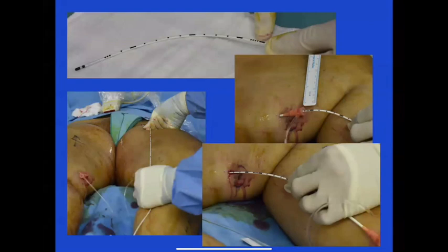These are some of the markings associated with the antennae. You can see the top picture showing where you start removing the sheath, and the 3 dots from the end of the antennae is basically showing when the last treatment should be used. Otherwise, there is the risk of actually damaging the skin.